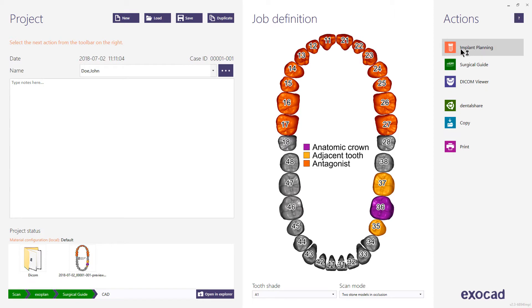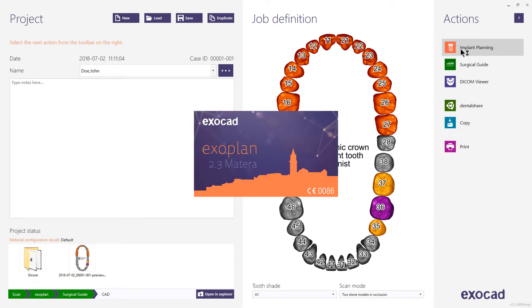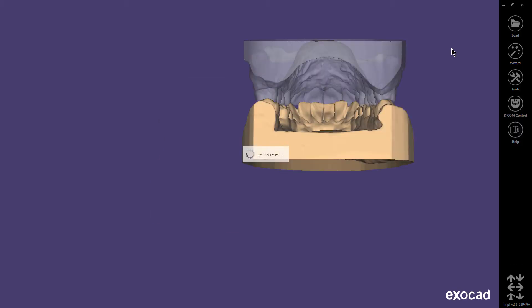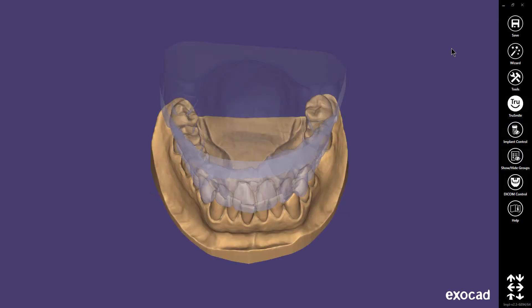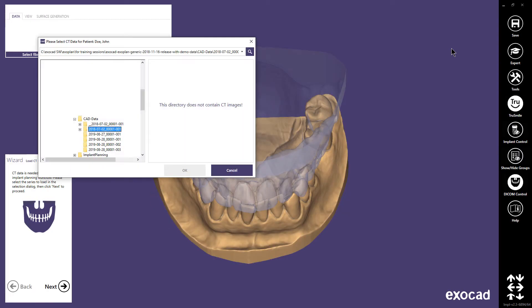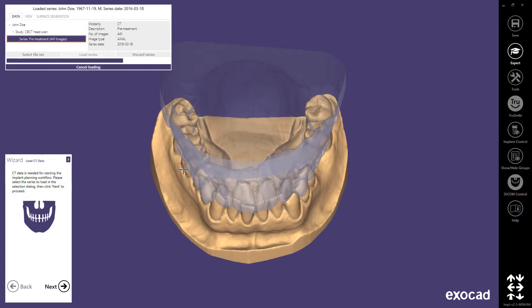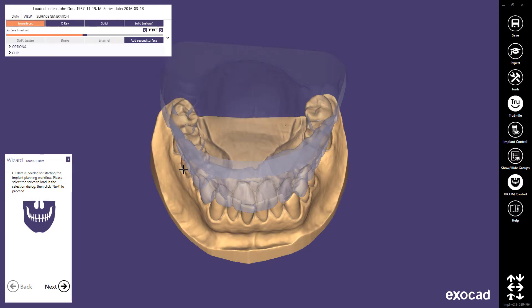The implant planning workflow will be shown in detail in a separate video. If you have an integrated scanner, your optical scans will be loaded automatically. If not, you will be prompted to locate and load the optical scans manually. Load the patient DICOM data. 3D CT input data shall have sufficient spatial resolution and be of high quality to allow recognition of all relevant anatomical structures.